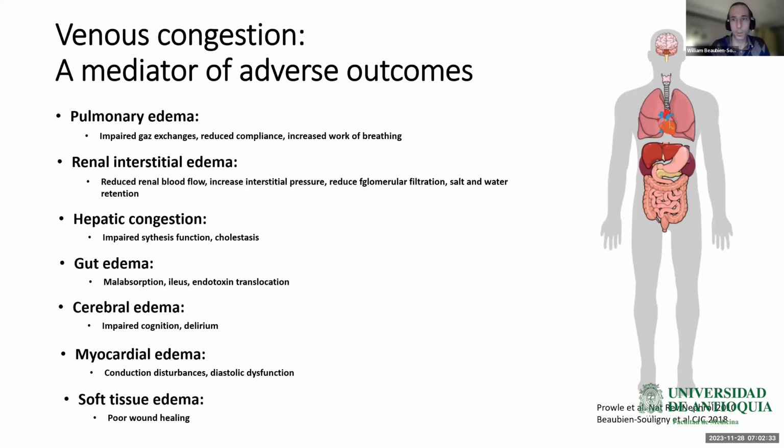More recently, there has been interest in a new site for venous Doppler interrogation. In 2020, our group published this case report titled Doppler Interrogation of Femoral Vein in the Critically Ill Patient, the Fastest Potential Acoustic Window to diagnose right ventricular dysfunction. This indeed came from our observation that compared to other sites of venous interrogation, the femoral vein is an exceedingly simple and fast technique to perform at the bedside.